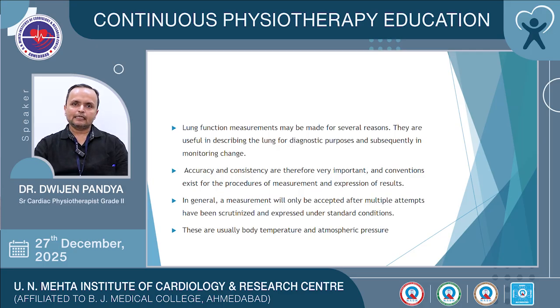The equipment present in the laboratory has to be calibrated, and the maneuver to be performed has to be explained thoroughly to the patients. The results are obtained and compared with the normal values for that particular subject. In general, a measurement will be accepted only after multiple attempts have been scrutinized and expressed under standard conditions. These are usually the body temperature and the atmospheric pressure.